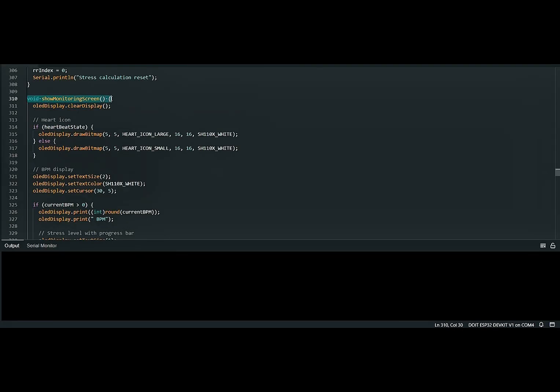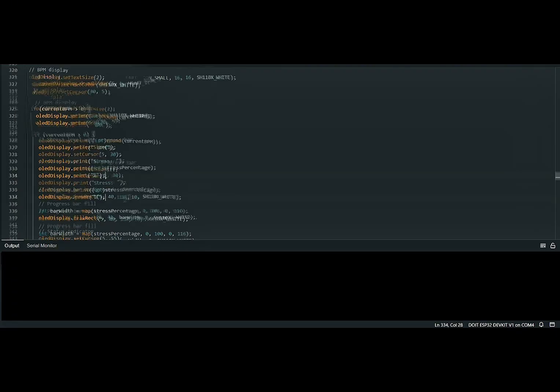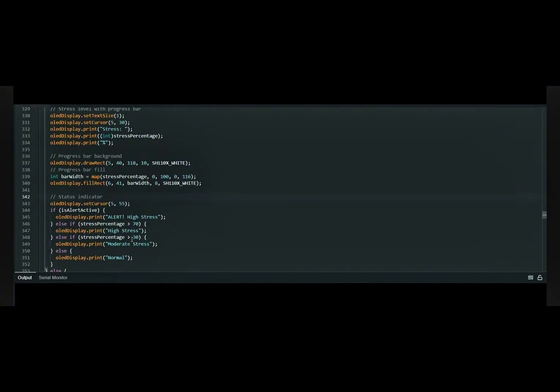Next is void show monitor. So it will happen when monitoring, and it will display the BPM, stress percentage, the stress bar, and the last line will show how stressed it is, like alert, high stress, moderate stress, normal, like this.